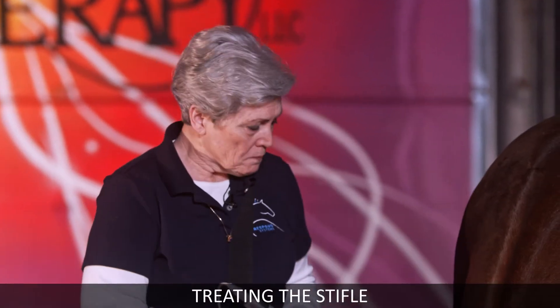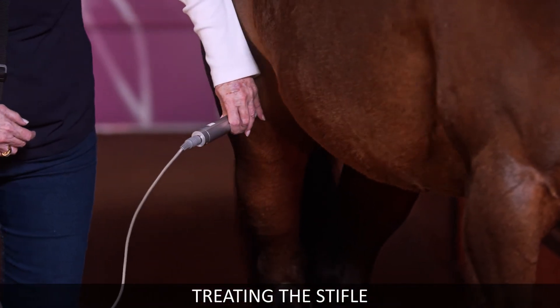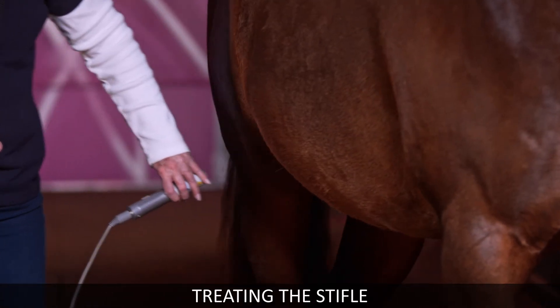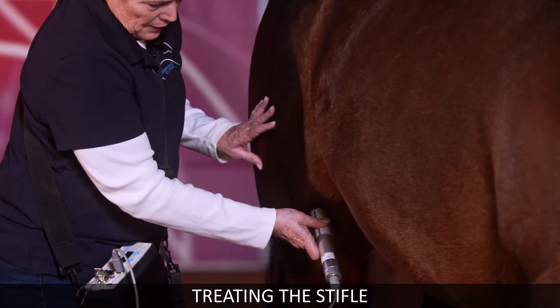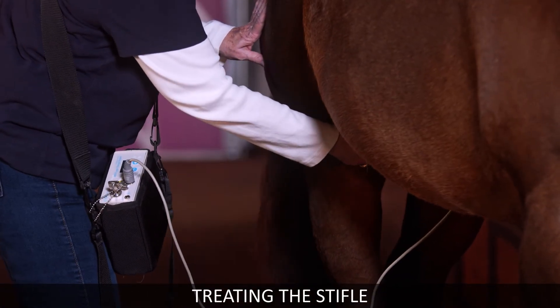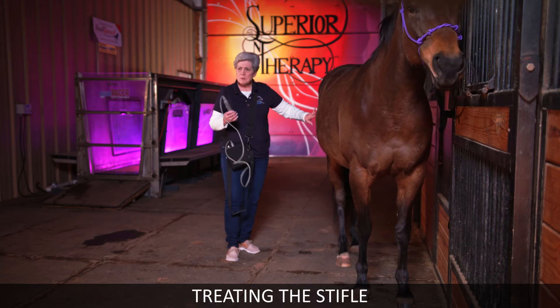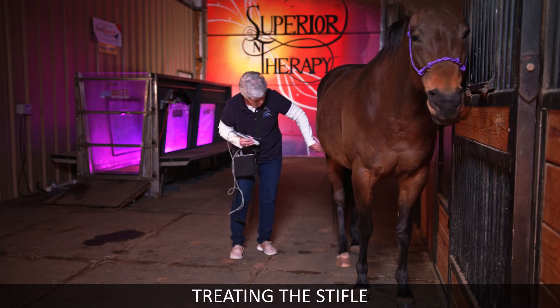Check and treat the stifle. When doing that, check the stifle first. If there's a lot of soreness, there are horses that have never kicked in their life that will kick with a stifle — it's a very tender area. Then treat on the inside. If there are problems on both sides, do the other side too. It's just a matter of treating the surface: one, two, three on the outside, and then the inside the same way.